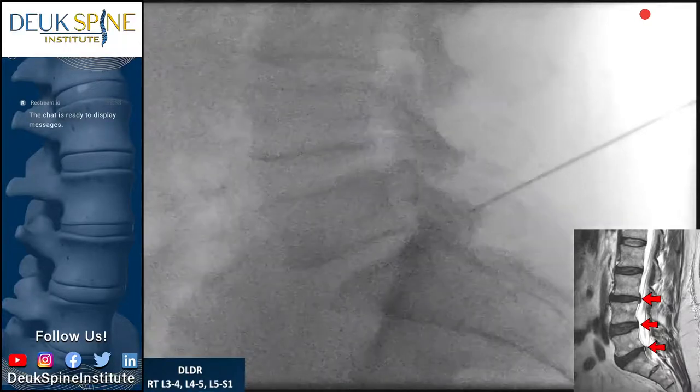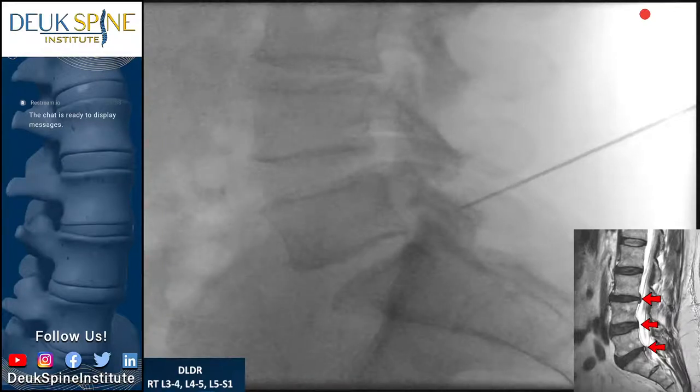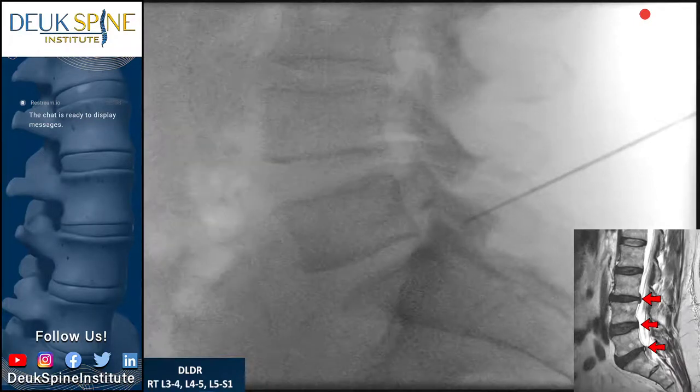All right, we're encountering the facet joint. So I want to redirect. Yeah, he's doing better now. How's our blood pressure? It's good? Are you happy with it? All right, we're on target right now for the L5-S1 disc. This is where he has his lowest herniation in his back.